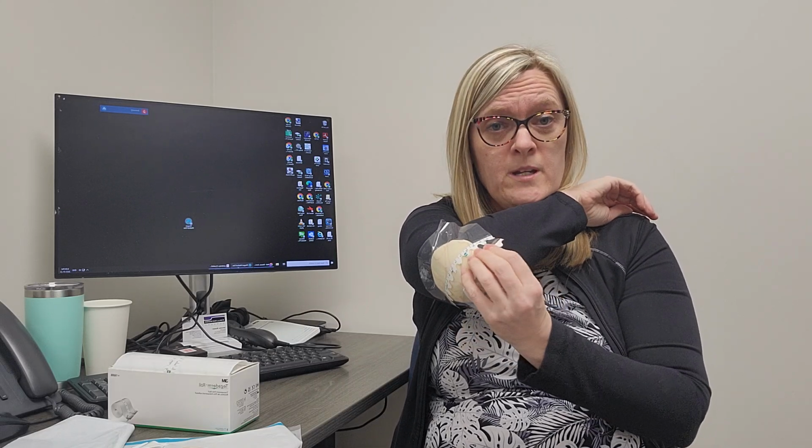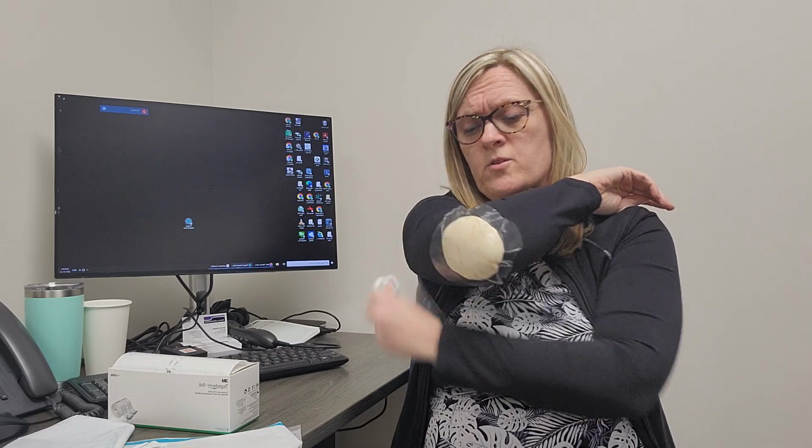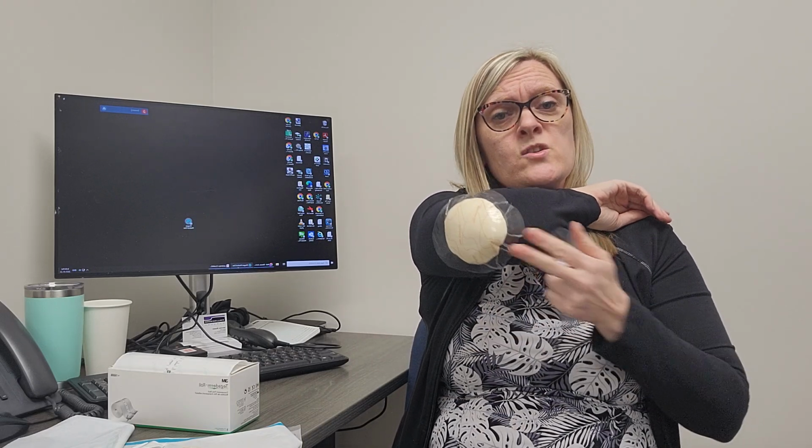So again, if you don't have the fancy foams, I know I love them because they're peel and stick, and I can use them just about anywhere, and they're non-adherent, especially with a skin tear. They can stay on. Now again, this type of dressing can stay on actually up to a week. If you do have a large skin tear, they're nice and padded, and patients tend to like it. If I have this foam on for the week, and we are concerned about that thin prednisone-like skin where there's very little dermis and it's very paper-like, you do want to consider, is the film going to be the best choice?